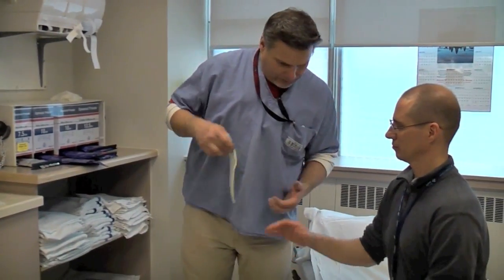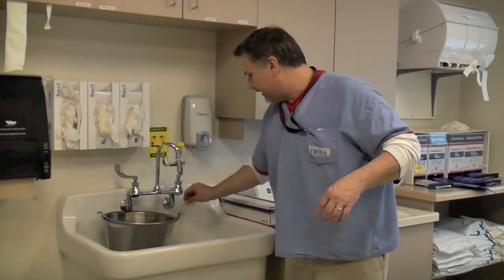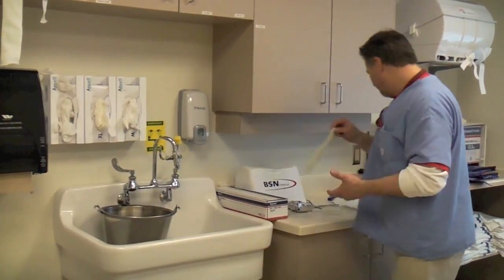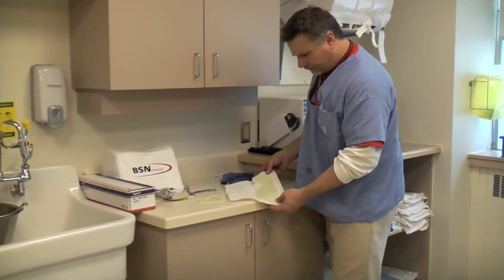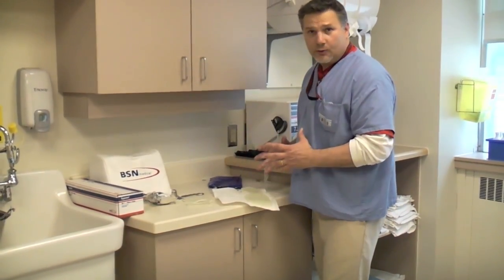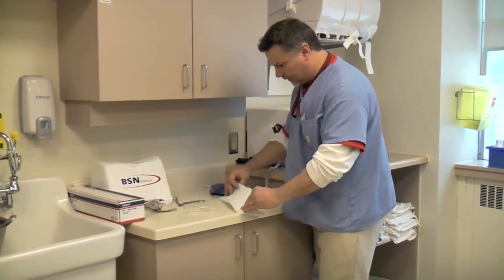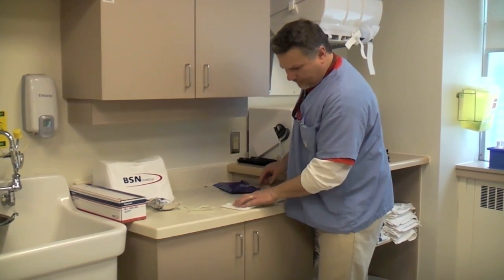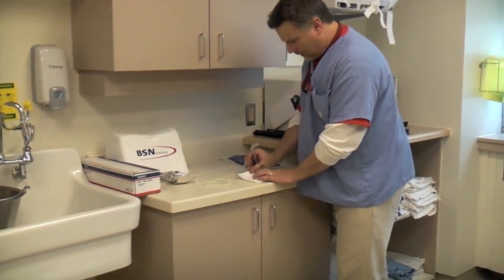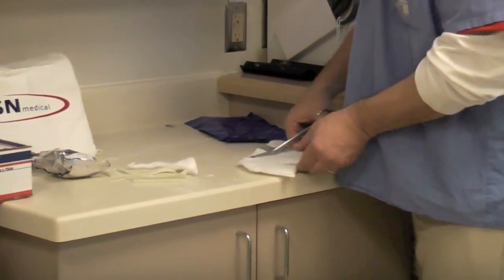We use the hand to make sure, palm up, that we're not too long. This has to be wet — it speeds up the drying process so you don't have to sit there and hold the cast for 20 minutes. You place it back into the felt. Sometimes the felt will shorten when you remove the product from it, so give it a pull — this stuff stretches. Once you get it to size, roll it over. You can take your fingertips and feel the edge of the fiberglass, and just to double check, cut out your patterns again and remove the thumb hole.